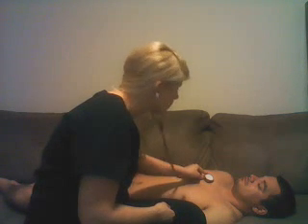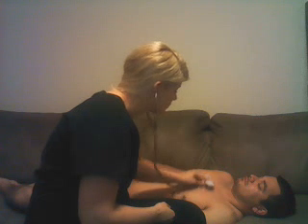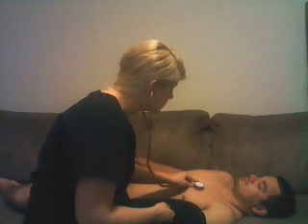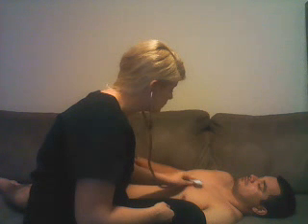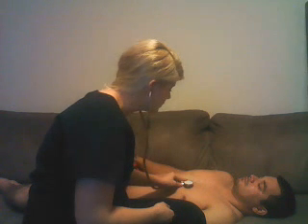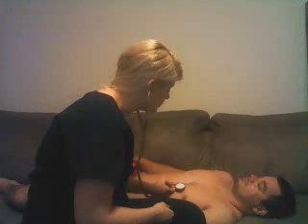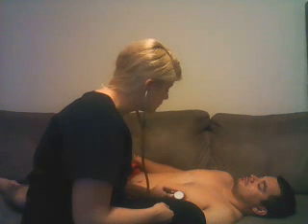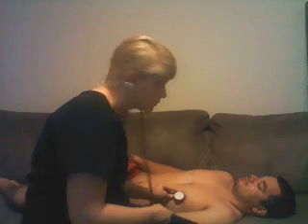Alrighty, then I'm going to do it all over again with the bell of my stethoscope. Okay.